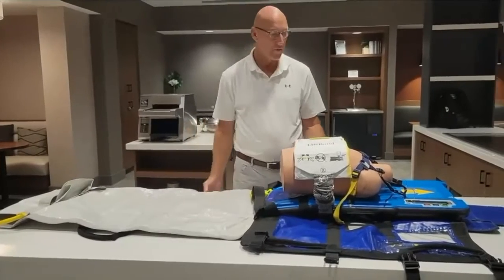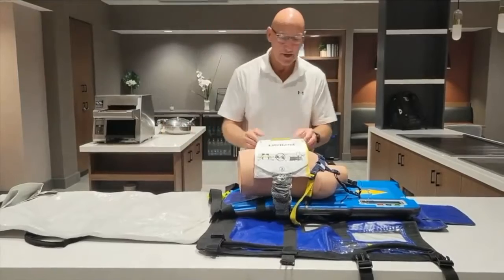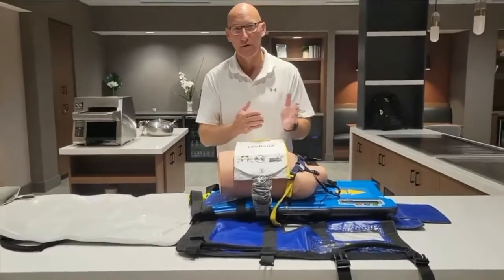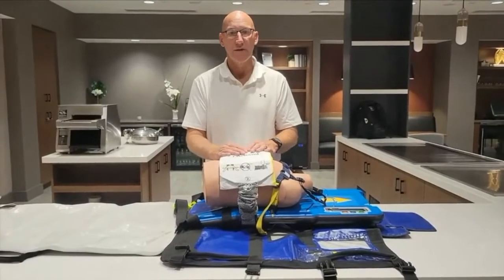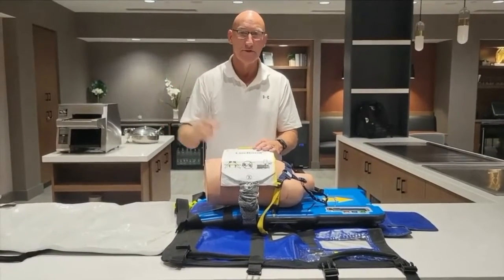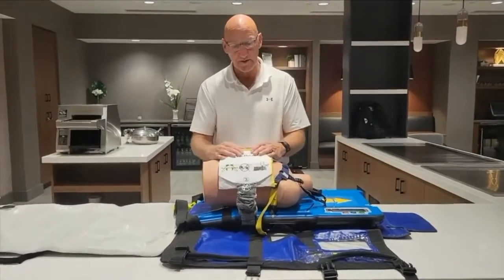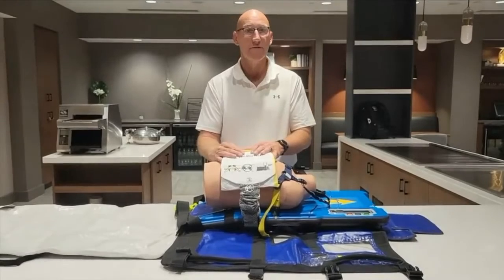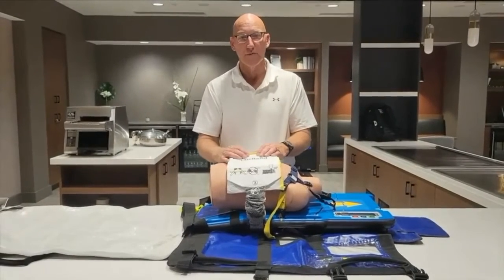Most importantly, there is no interruption in blood flow during transport or extrication — whether going from upstairs to downstairs, or loading them in the back of the truck. The safety aspect of this also allows your providers to sit down and be safe, while continuing the most important medicine in the treatment of cardiac arrest, which is blood flow.